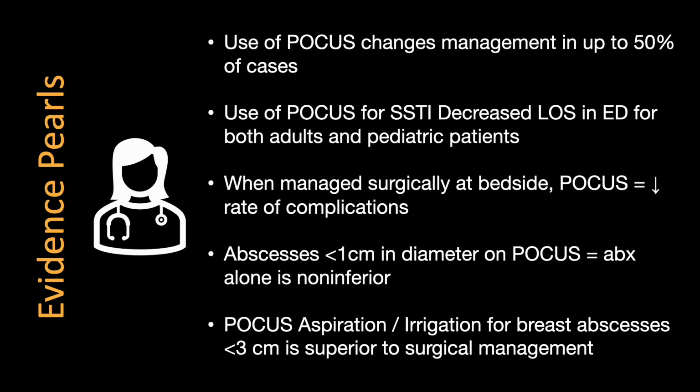Some of these patients may be good candidates for a trial of oral antibiotics if they have a good understanding, you've counseled them well, they have adequate follow-up, and they consent to the risk of delaying treatment if the antibiotics are insufficient. Lastly, for breast abscesses that are small, POCUS-guided aspiration is considered a better treatment than surgical I&D, which usually has to happen in the OR due to the significant pain associated with these lesions. So we can potentially save a patient from the risks and costs of general or regional anesthesia and a hospitalization if we can successfully treat these with minimally invasive procedures.